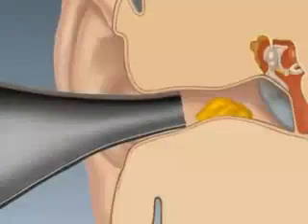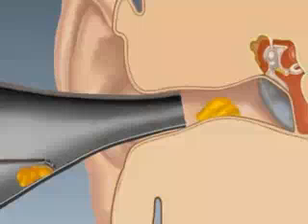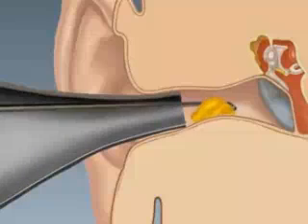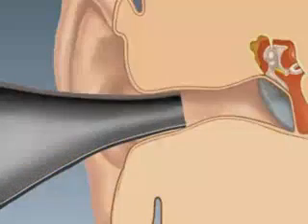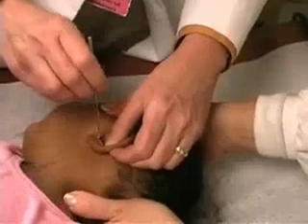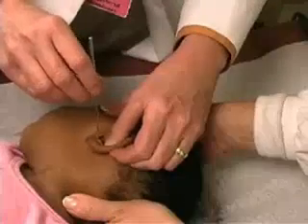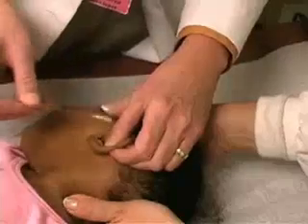Do not attempt to break through the cerumen, as this may result in further impaction. Rather, try to pass the loop of the curette behind the piece of cerumen, being careful not to traumatize the walls of the external auditory canal or the tympanic membrane with the curette. If small amounts of cerumen still remain, insert the triangular applicator wrapped in cotton approximately 0.5 centimeters in the canal. Twist the applicator while withdrawing it from the canal.